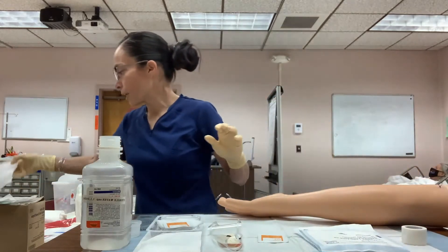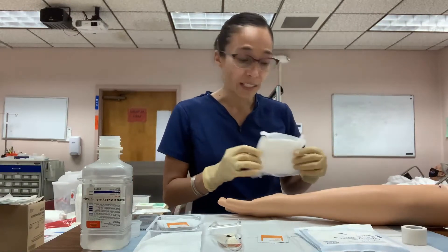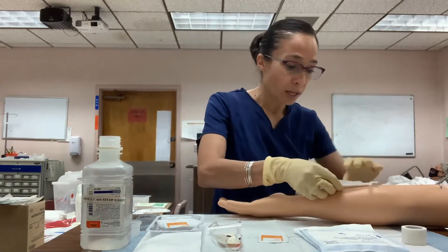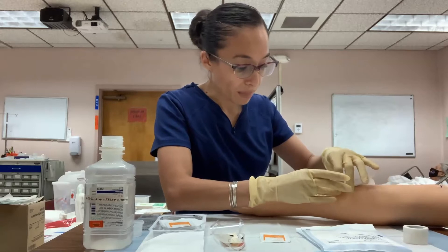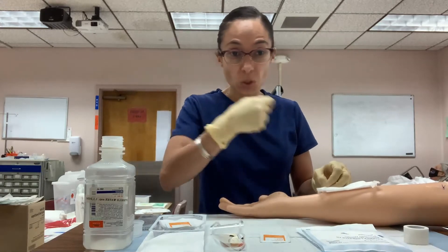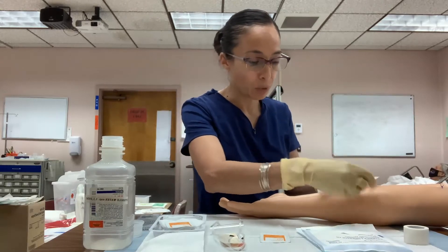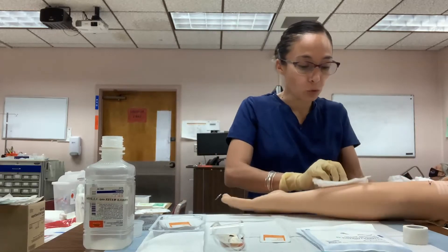Introduce yourself and let the patient know you're ready for the staple removal. Sometimes patients may have a dressing over the staples or sutures depending on doctor's orders. If there is a dressing, carefully remove it using the pull-and-hold-the-skin method. If the tape is firmly attached, you may need normal saline or an adhesive remover swab to help loosen it.